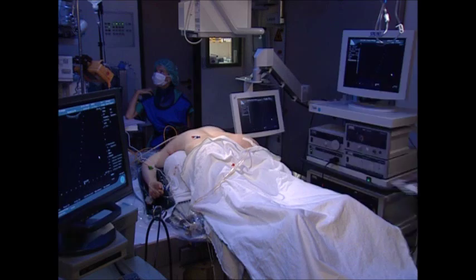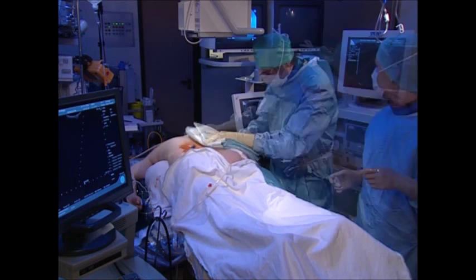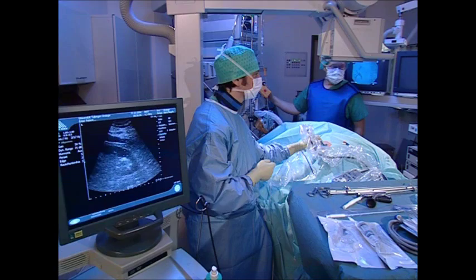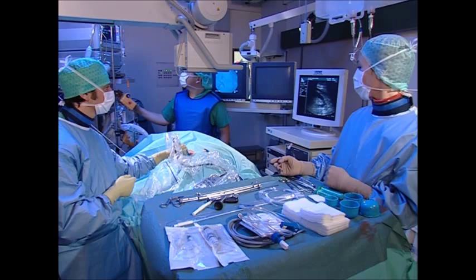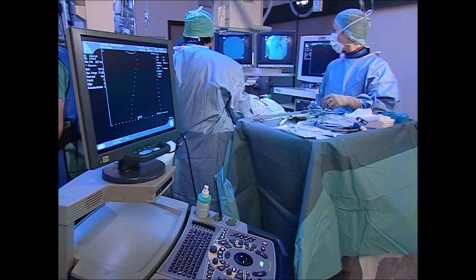This is followed by sterile washing, draping of the patient, and preparation of the instrument set. Rapid and safe surgery requires optimal positioning of the x-ray and endoscopy monitors, and a practical arrangement of the feeds for irrigation, ultrasound, light and camera cables, and, if relevant, for lithotripsy.